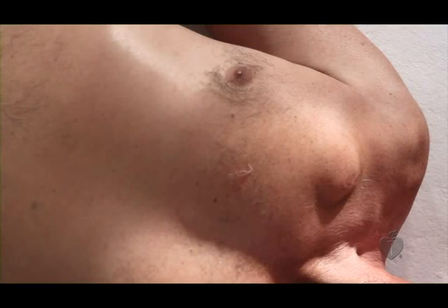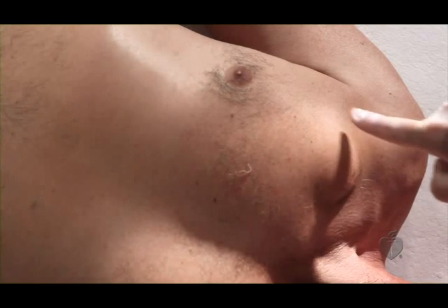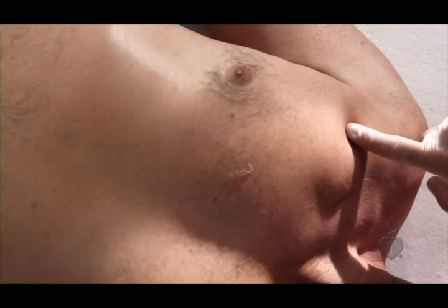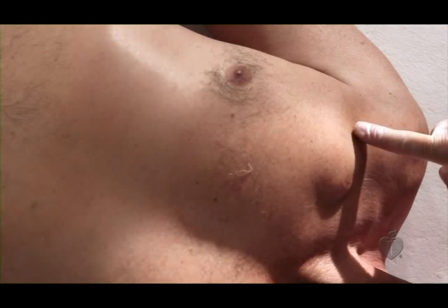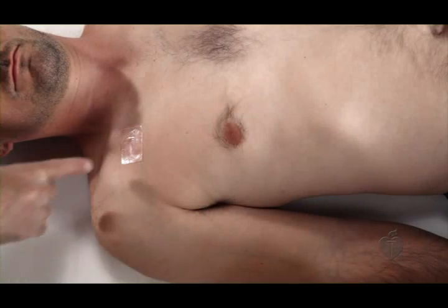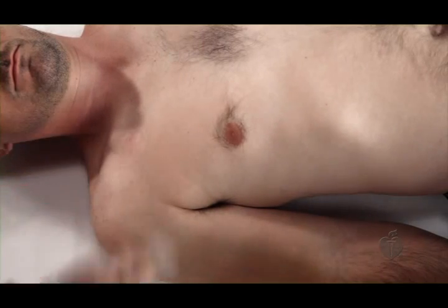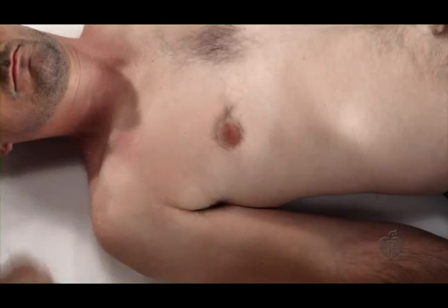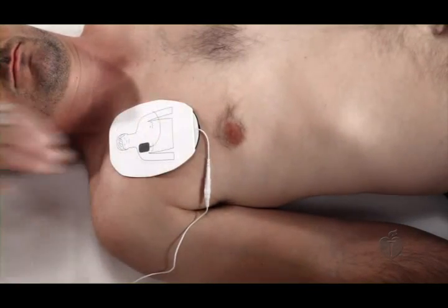Some people have implanted pacemakers and/or defibrillators in the same place where you would put the AED pads. The device will look like a round or square lump, smaller than a deck of cards. If you see this lump, try to avoid putting the pad directly over the lump. Do not place the pad directly over a medicine patch. If the shock delivery will not be delayed, take the patch off and quickly wipe the chest before you put on the pad.